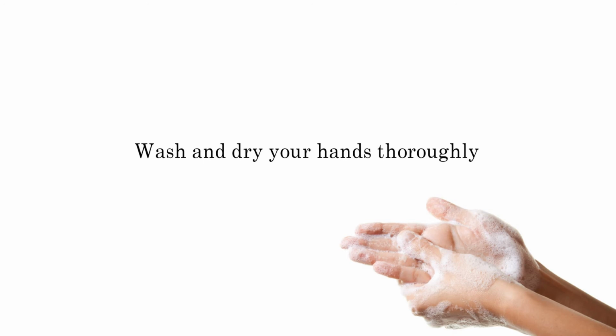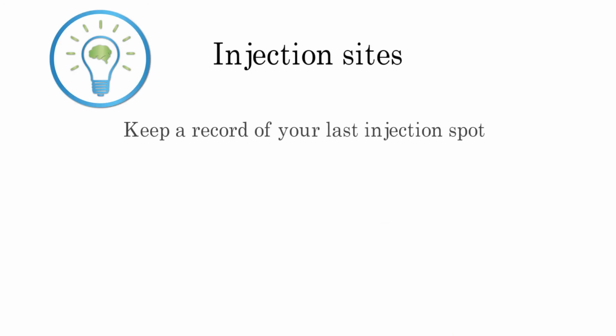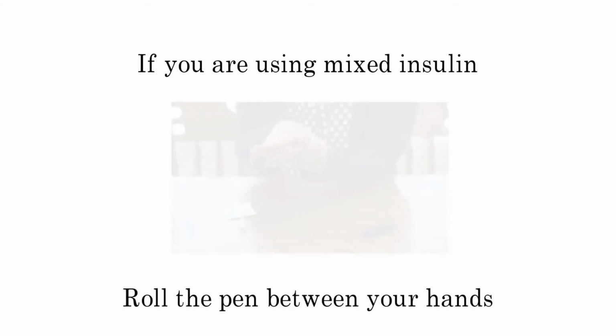When using insulin pens, wash your hands and pick an injection site. It's a good idea to write down where you inject each time in a place that's convenient for quick reference in order to avoid a buildup of scar tissue.